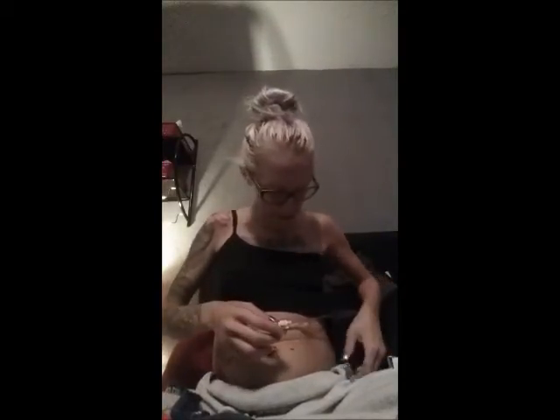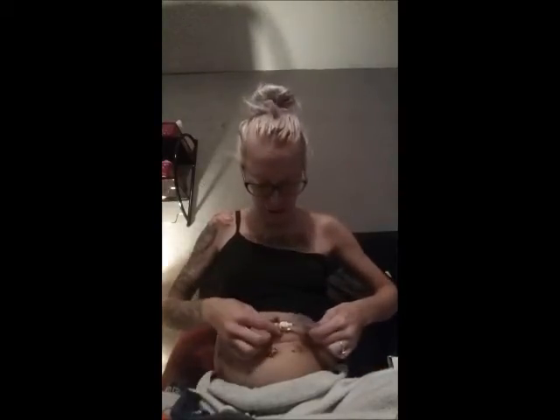So this is your regular feeding extension that comes with your Mickey button, and when you order supplies every month, they ask you if you need extensions. I get a good week out of one of these if you clean it really well, sometimes more. And like I said, it locks into your Mickey button. So here's my feeding tube, and when you push it in like this, as long as your lock is lined up, you just turn it and it can't come off. See, it can't come off.